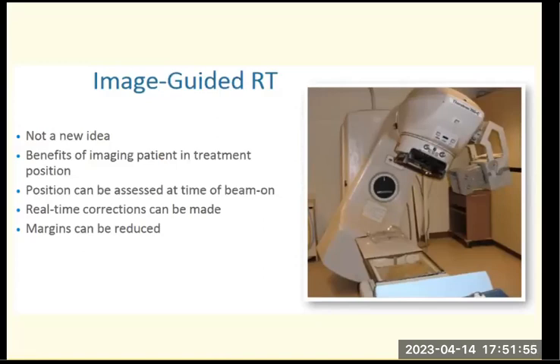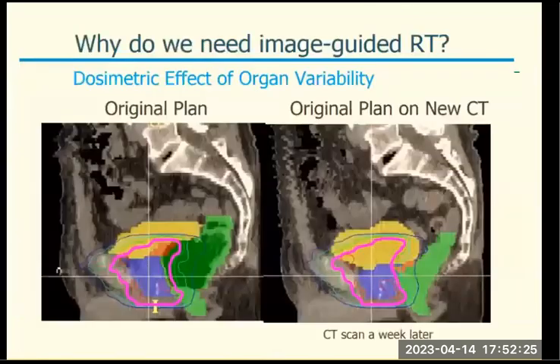In the previous cases, IMRT and CRT etc., we don't take images regularly. Frequent imaging is not taken. In image guided RT, as the name indicates, we will be frequently reading the information about the tumor treatment through the image, and accordingly the treatment progresses. That is the meaning of image guided RT.